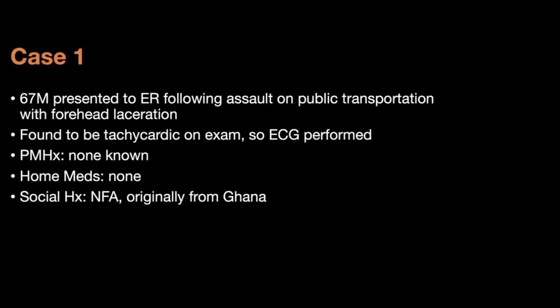All right, the first case. I'll give you a quick summary, and then I think we have a few of the cardiology residents here to walk through things. The first case is a 67-year-old gentleman who presented to the emergency room following an assault on public transportation, and he had a forehead lac, which was stitched by emerge. He was a bit tachycardic, so we routinely did an ECG in the ER. He had no known past medical history or home medications. Demographically, he was from no fixed address, and originally from Ghana.